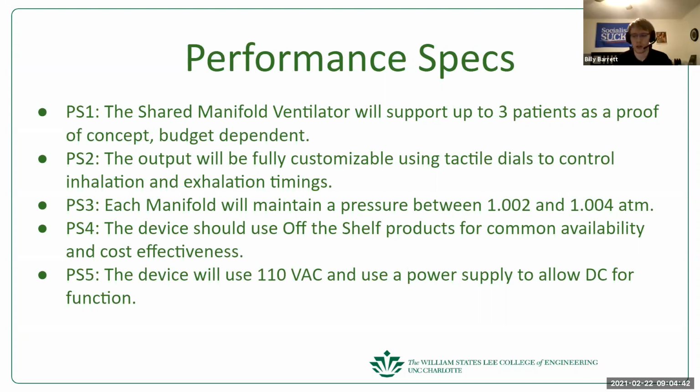Yeah, I was thinking even a little more complicated, like doing it in code and using whatever pressure we're getting from the tank, but I had forgotten that it would be adjustable. It'd be great if it could be self-regulating. And that's what the regulator is supposed to do, but it does have to be set.